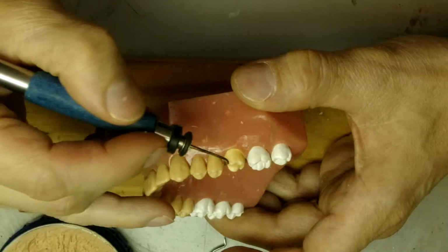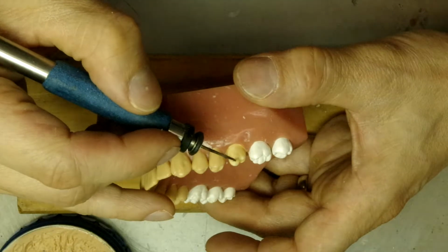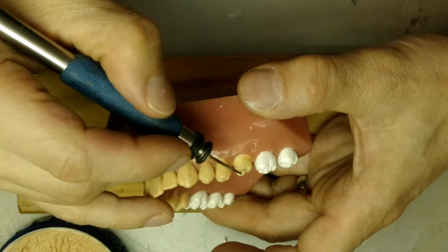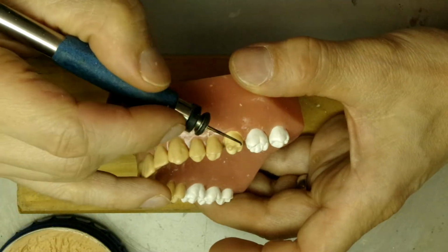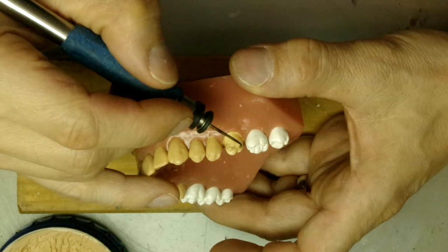So we start with the buccal cusps. At least I do. This will allow me to bring it up to the line of the curve of Spee.